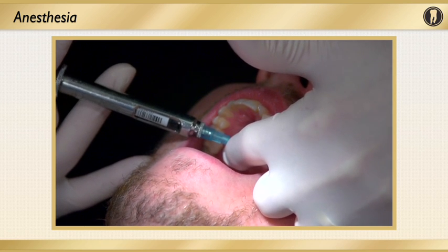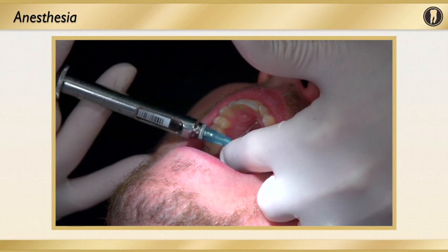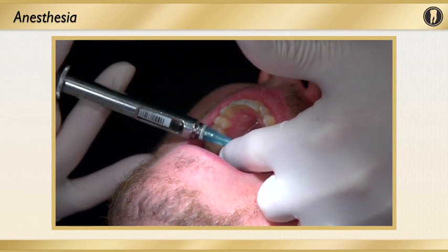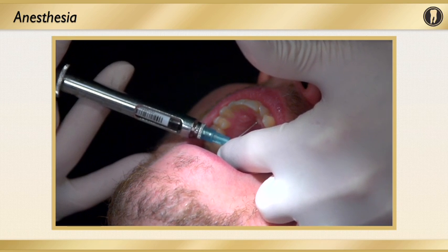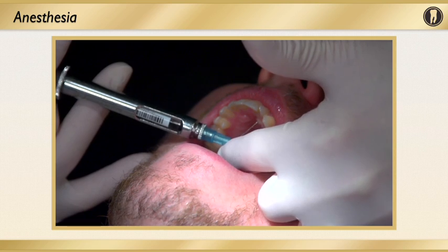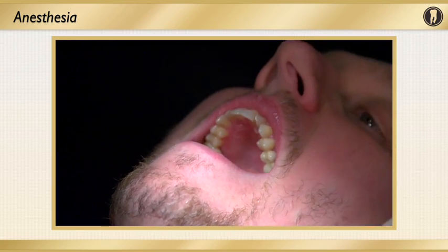Now sometimes that tissue is really tight, and you'll find that you cannot get the lidocaine into the tissue. So I'll actually put my finger on the needle to hold it as I move it up, out, just a teeny bit. I'm not going out of the tissue, and I'm trying to find the right spot so that I can gently extrude the anesthetic.